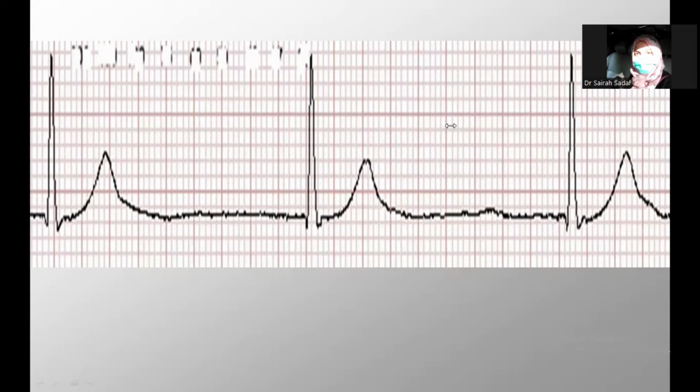All right. So it's a bradycardia. Okay, good to have you. Thank you for joining. Yes, Jennifer, 33. Good. Okay, so the heart rate is 33. So this ECG shows that the patient is having bradycardia with a heart rate of 33.